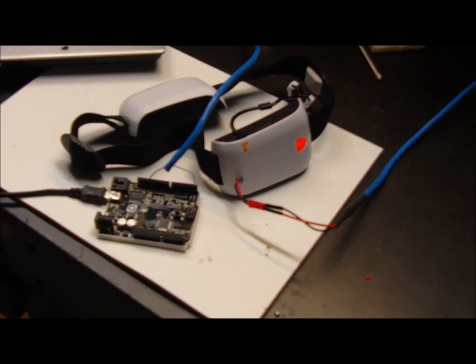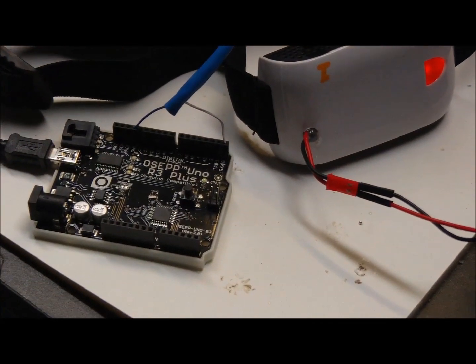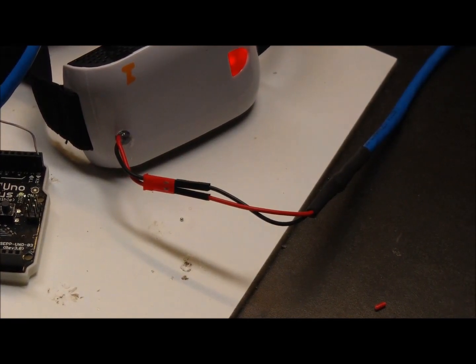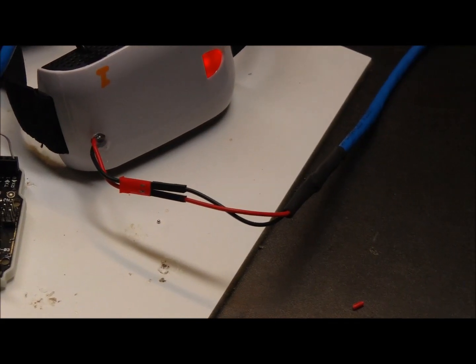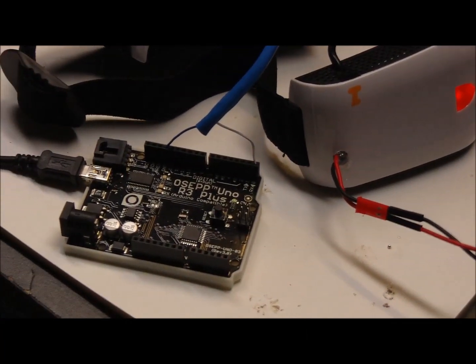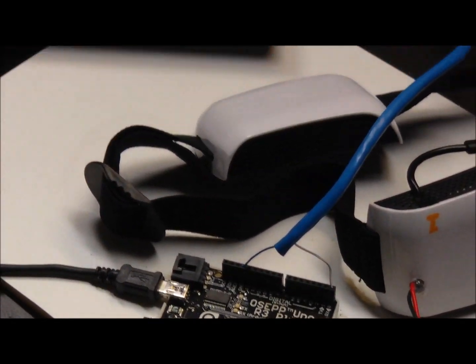So what I've got here is I took the Arduino Uno and hooked it up from the previous video. I ran out the connector. Unfortunately, I don't have a mating connector for that right now, so I used some male 1mm pins and some Cat5 solid core Ethernet cable, just because I have a whole roll of it. Ran it back to the Arduino Uno.